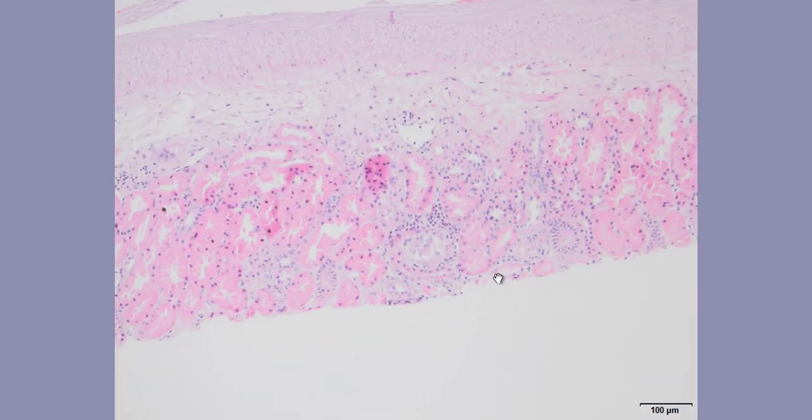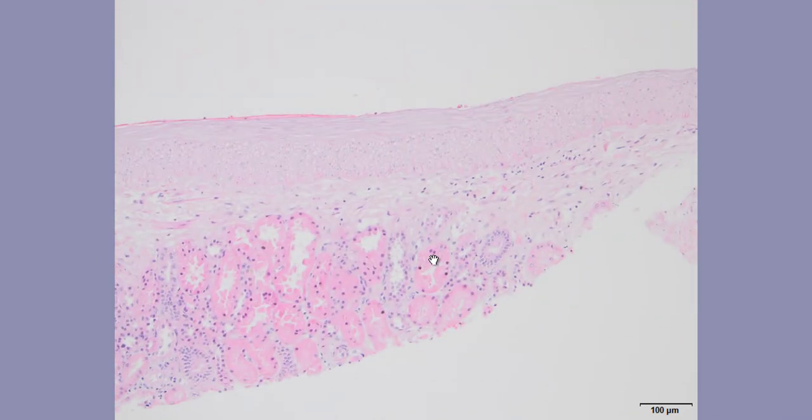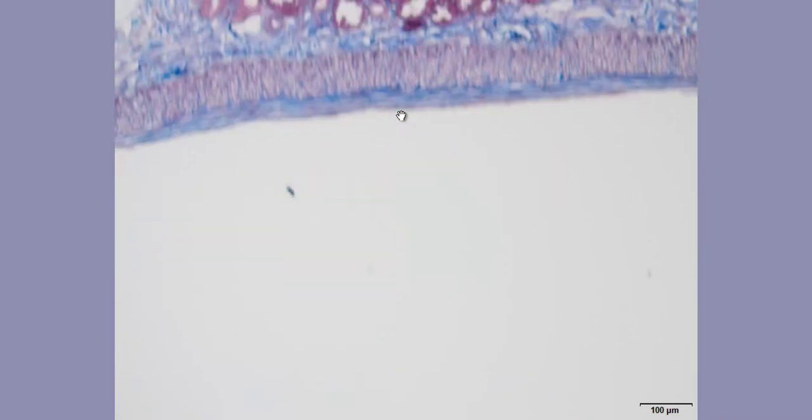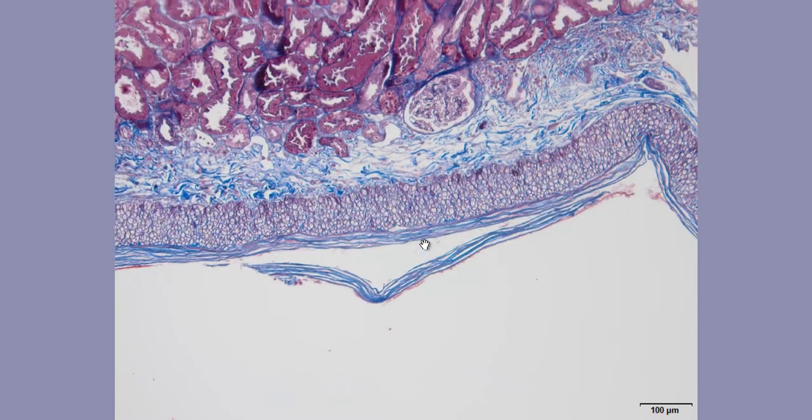and we're going to keep an eye on this glomerulus as well, where, as you can see, we've started seeing some inflammation. There's an artery here, biopsied along its length, and you can see that the intima is quite thick, which is probably due to hypertensive changes in the donor. Now, when we look at the trichrome stain, intimal fibrosis, as we said, is much easier to appreciate here. The intima is really thick with fibrosis.